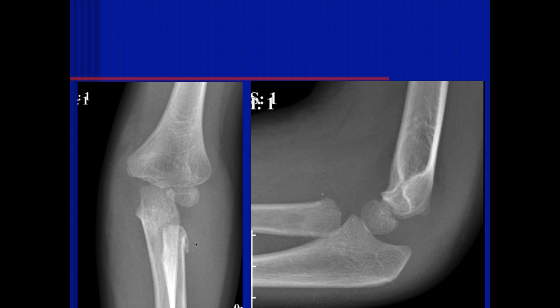Where do you think that radial head may be? That's what I'm wondering, if there's radial head that's popped off and is now down there. And there's a big one. I think you're on the right track. There's a large joint effusion. You can see the sail sign and the big posterior fat pad and a lot of soft tissue around the elbow.